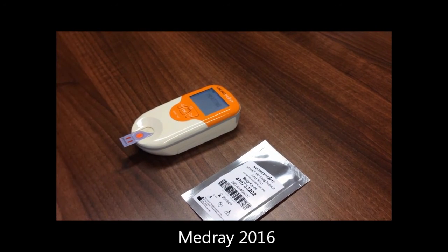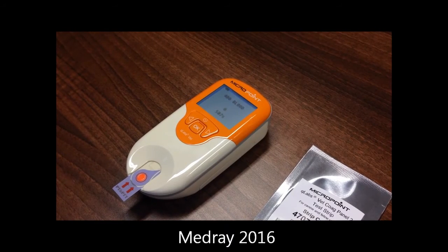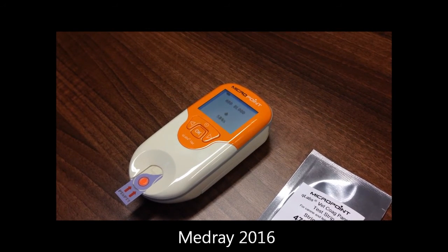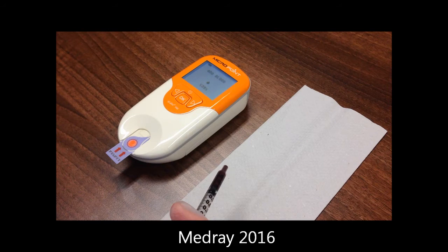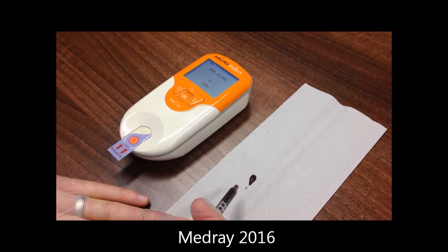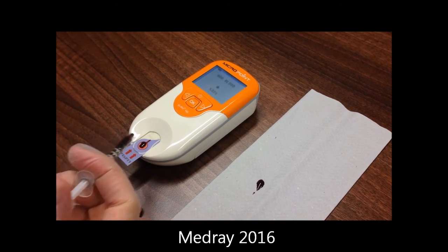The analyzer will heat the strip and display 'Add Blood' once the correct temperature has been reached. You will now have up to 10 minutes to introduce the sample. Collect venous blood into a plain syringe and remove the needle. Immediately dispose of the first drop of blood into a tissue and apply the sample directly onto the well of the strip to start the test.